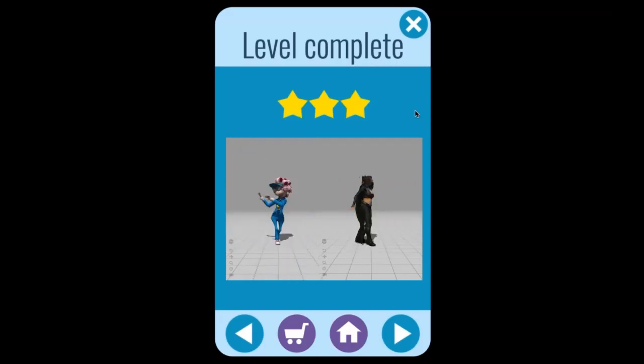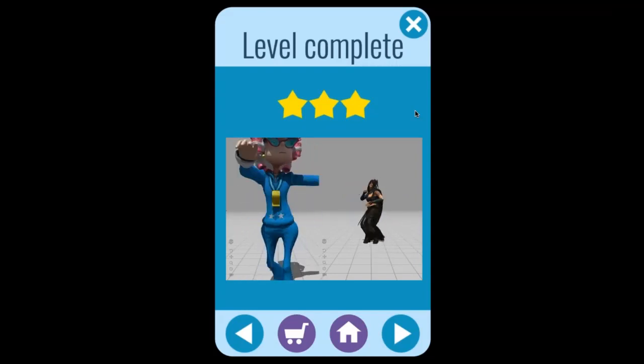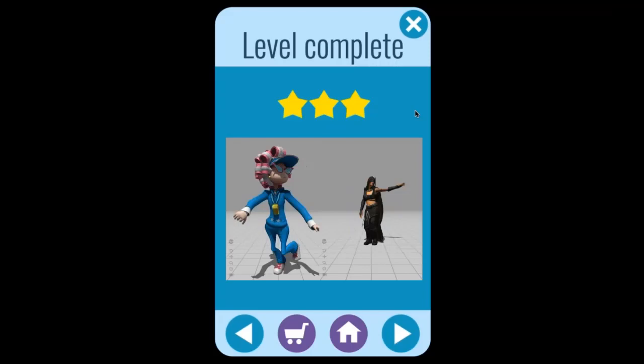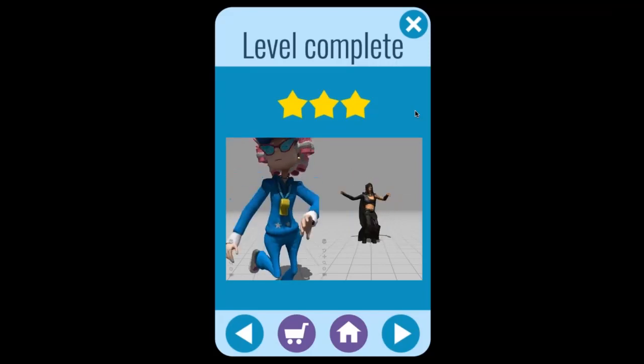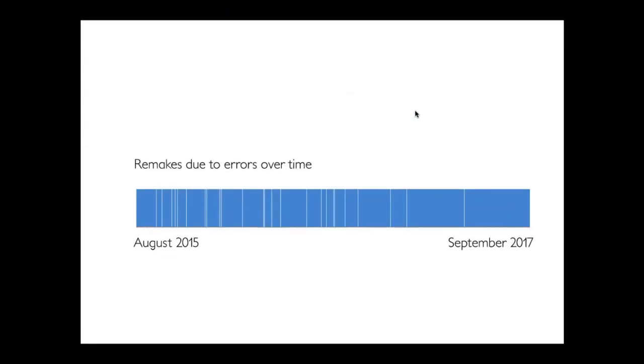So because digital dentures are so easy to generate again and again and make precise changes, I have made the move to not doing a final try-in, and taking the risk that the changes I'm prescribing from my try-in will possibly require a remake. So I pulled my personal statistics. How many times do I have to remake dentures because of errors over time? And you can see here that out of 481 denture orders in the past 2 years, there have been about 25 remakes due to errors.